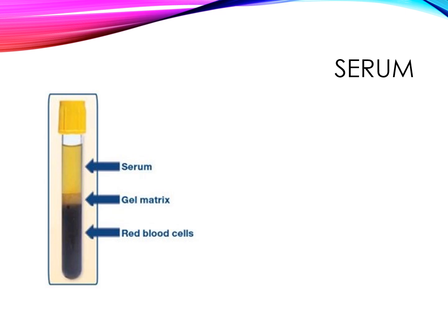And because the density of the gel is designed to be somewhere in between the density of the blood cells and the density of the serum, once you centrifuge the sample, the gel will be in the middle and the cells will be on the bottom and the serum will be on top. And once again, this is serum because the blood has clotted in this tube.